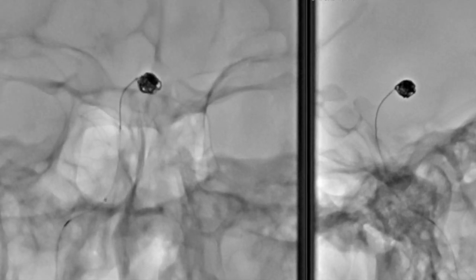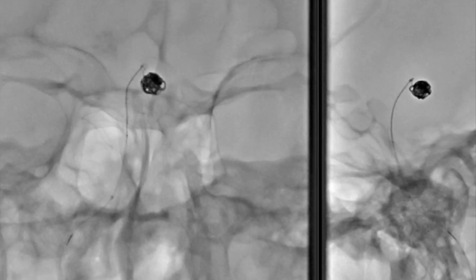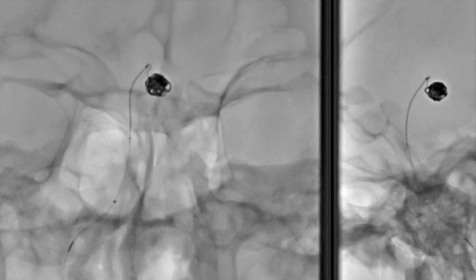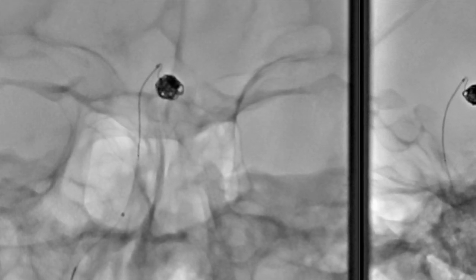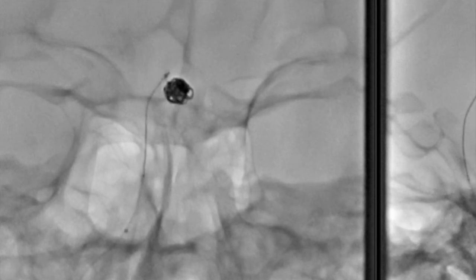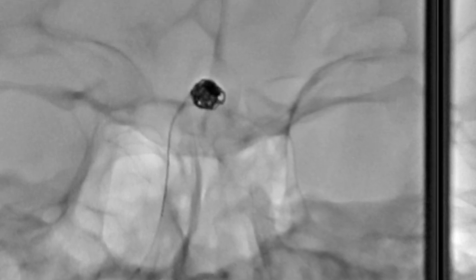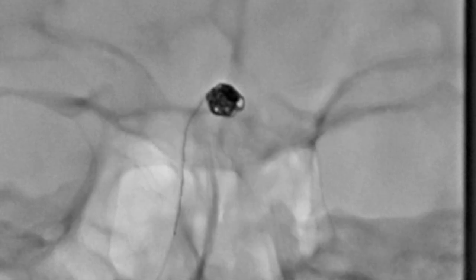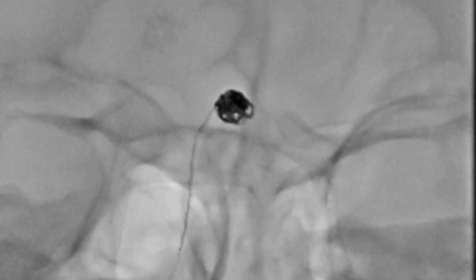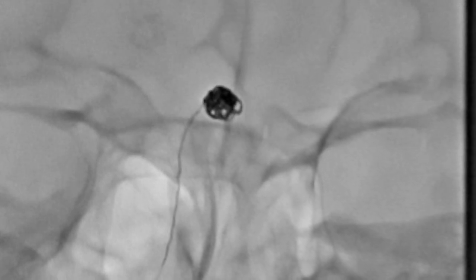They are extremely soft so that they can be delicate going into the aneurysm. And here was really interesting. We got into a really tight spot there. The coiling catheter had left the aneurysm while I was trying to still put a coil in. And then being really careful and really gentle and not losing control and just being really calm, I was able to sneak that catheter back into the aneurysm and finish coiling the aneurysm. And it went really nicely.